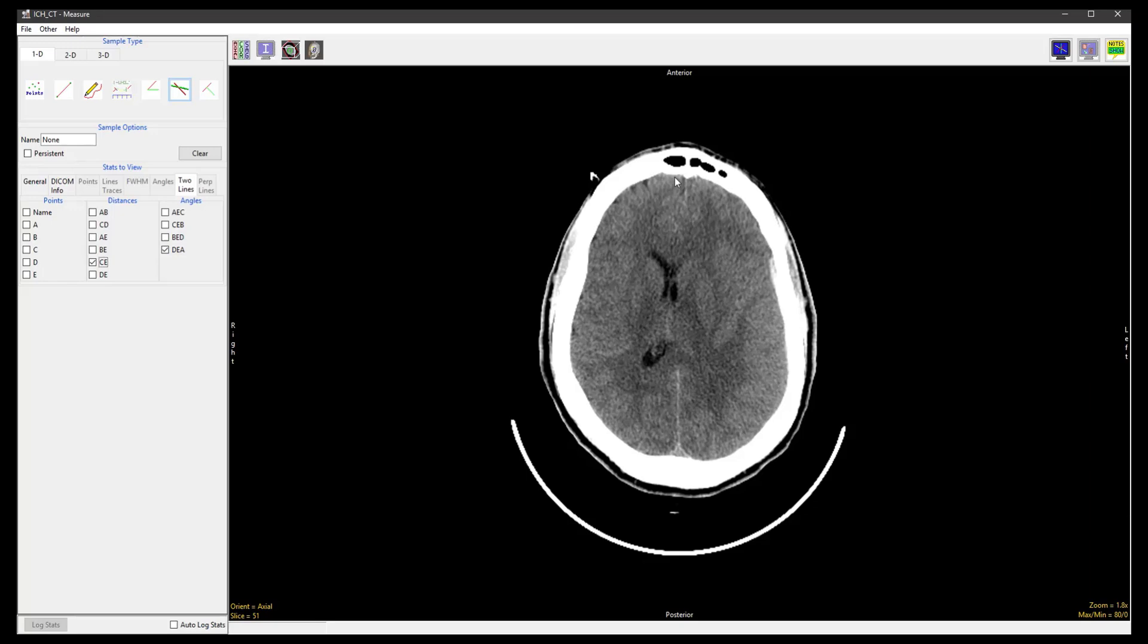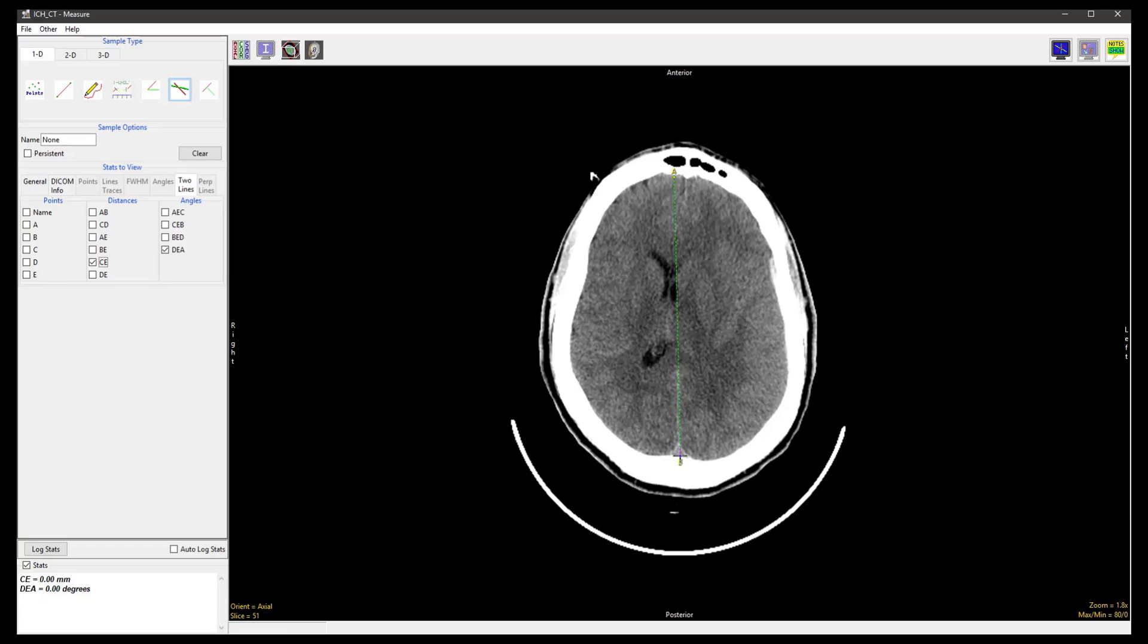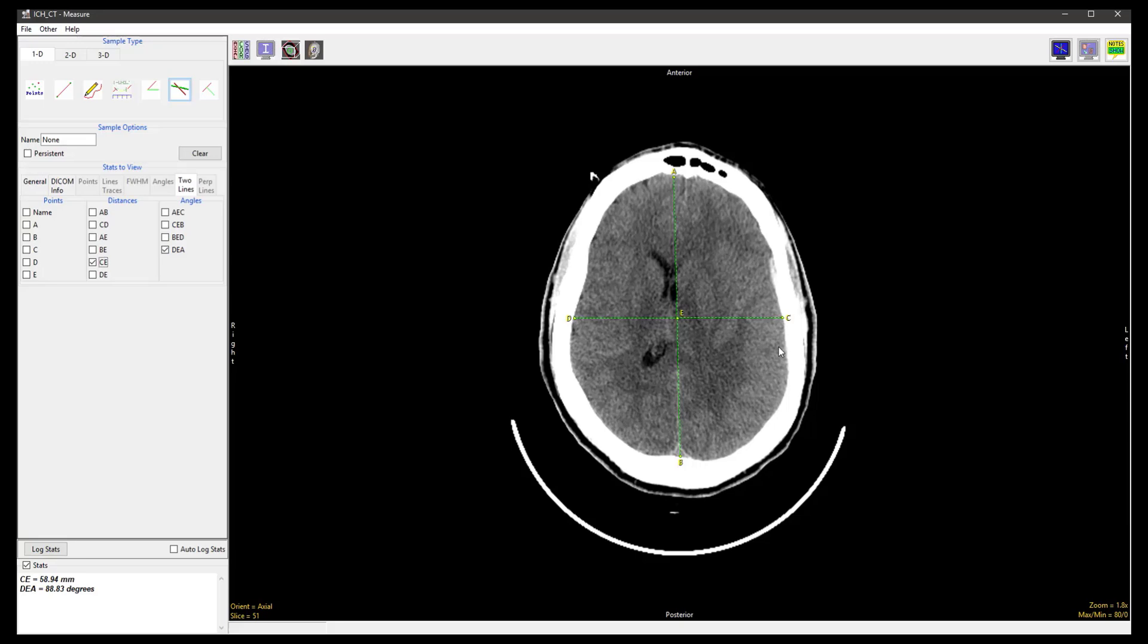First we will define a midline AB, and as soon as the mouse button is released, a perpendicular line CD will automatically appear. Points C and D can be relocated to the desired locations.